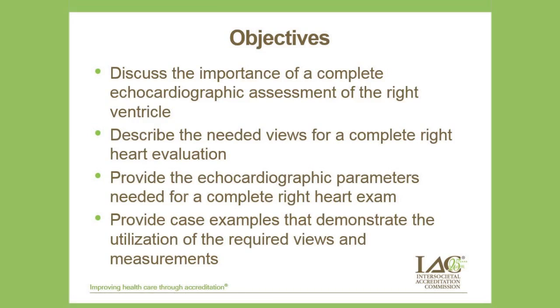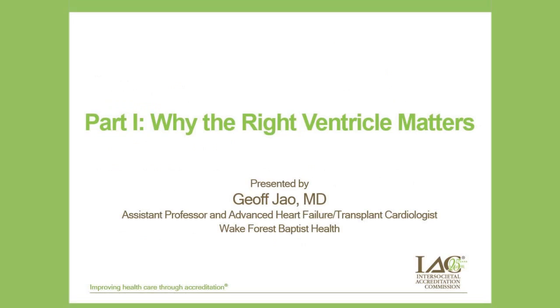The flow of this presentation will be, number one, to discuss the clinical evidence as to why we should care about the right ventricle. And then as we proceed, we go to the meat of the discussion, which is echocardiographic assessment of the right ventricle. And then we'll end up with a few cases to discuss to tie what we just learned and apply it in real cases. So without much ado, let's proceed.